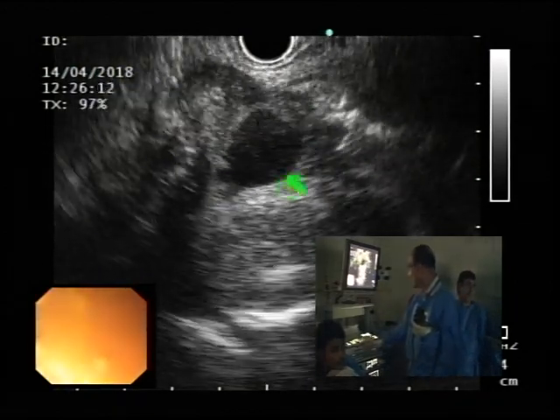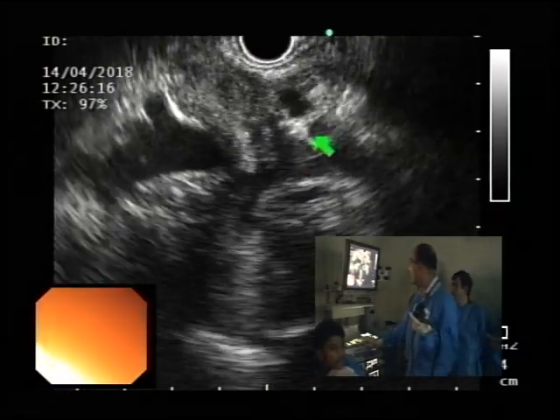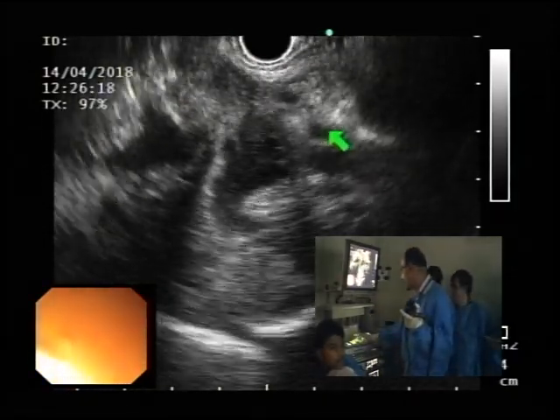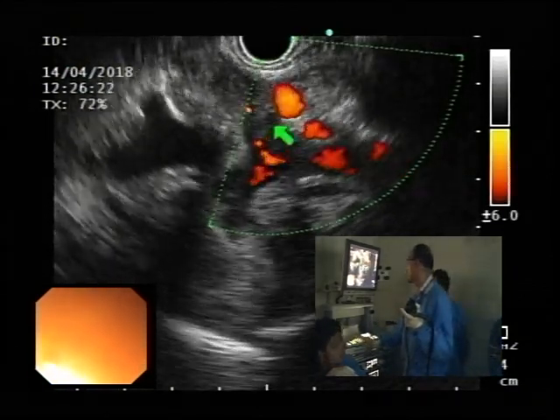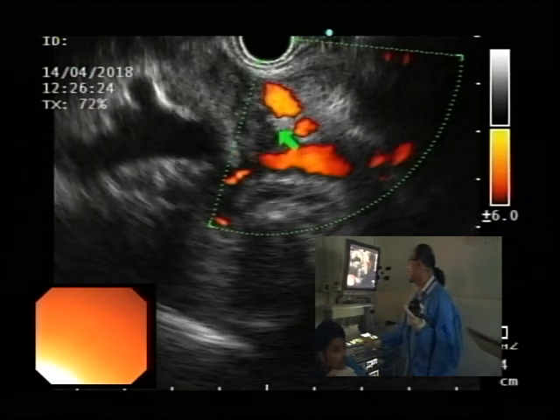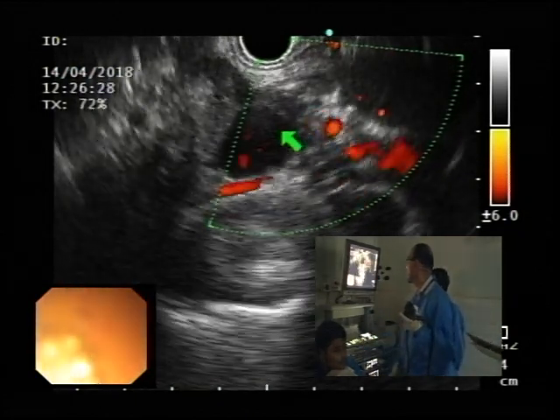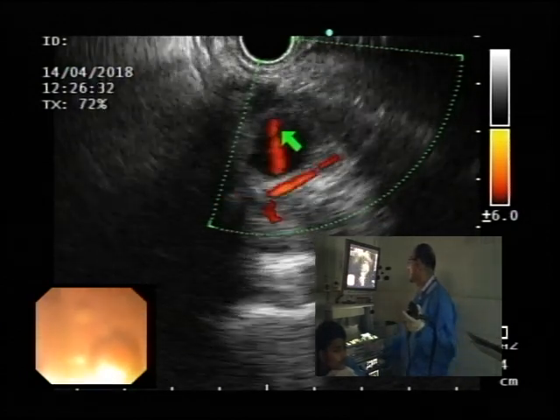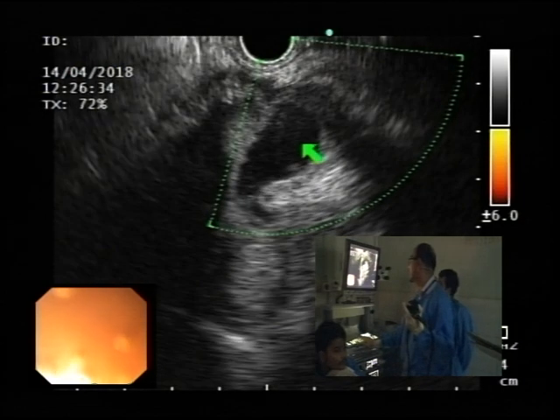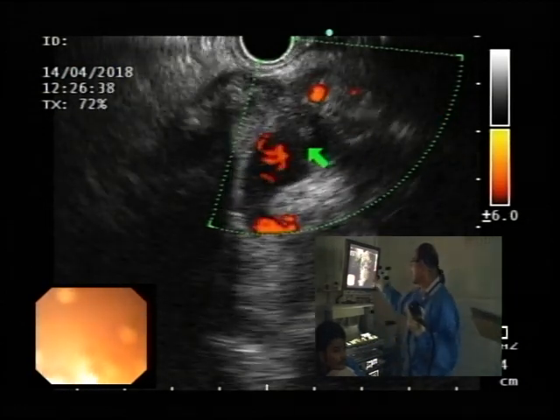I think this is a grossly, okay, pichli dafa grossly abnormal dilated duct tha, and this is where the benefit of Doppler comes in. You can put Doppler on to see ki bhai ye vessel hai ki duct. And actually I think what's going on is that this is the true duct, that is artifact, but ab ispe dekhen, there is no Doppler flow in it, and that's a markedly dilated pancreatic duct heading down towards the neck.